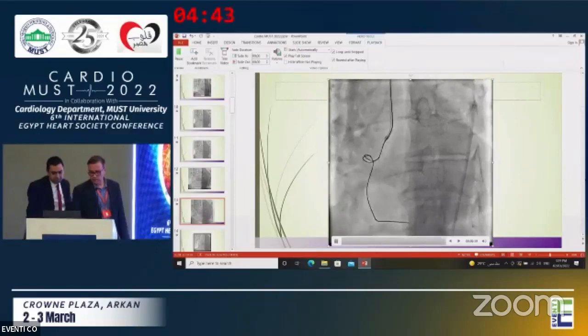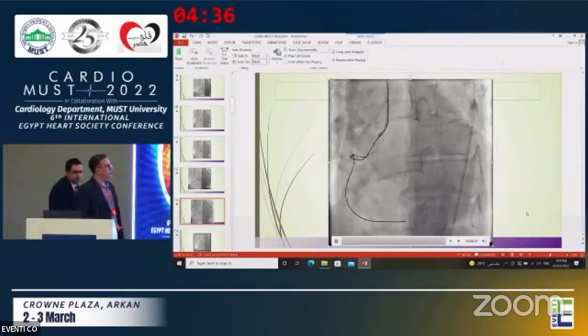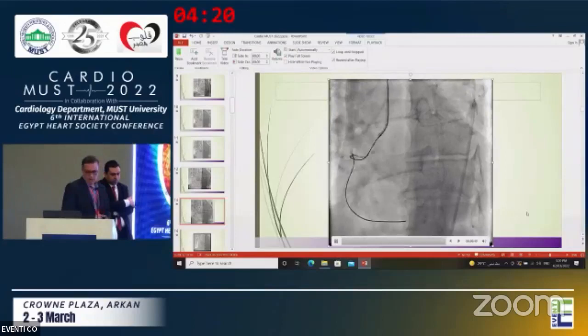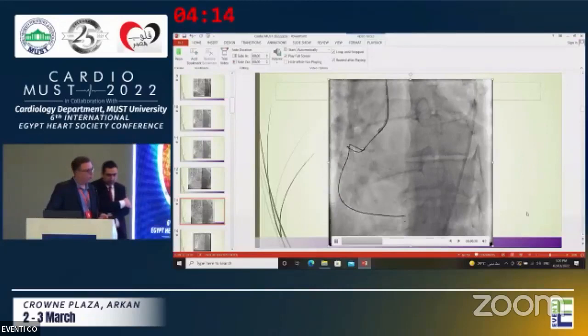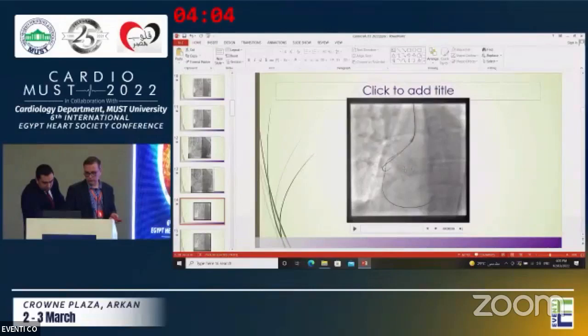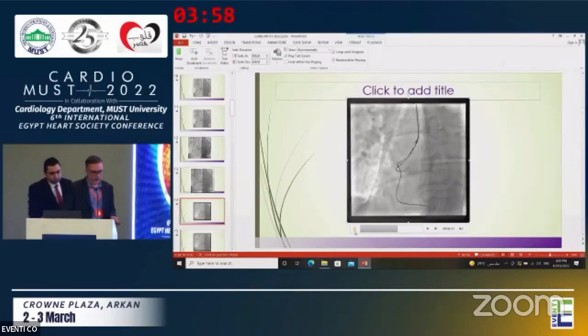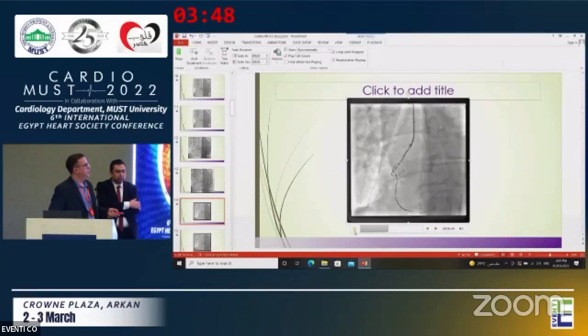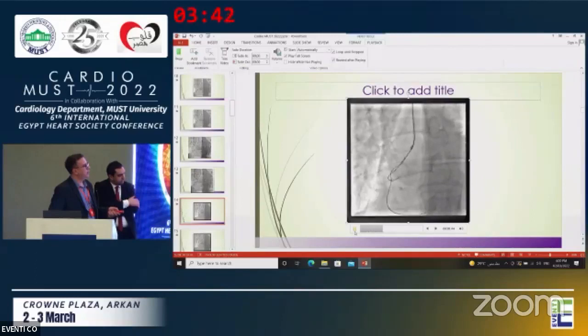We have here my retrograde wire changed through the Finecross — that dot is the Finecross tip. I started antegrade because I cannot cross with the retrograde wire to the CTO segment. I put my antegrade wire to prepare for reverse CART — one of the techniques for the retrograde approach. After that, we have my retrograde wire, an antegrade balloon 2.0 for reverse CART, approximately 2.5 for this artery. I cross through the CTO segment and go to the aorta.